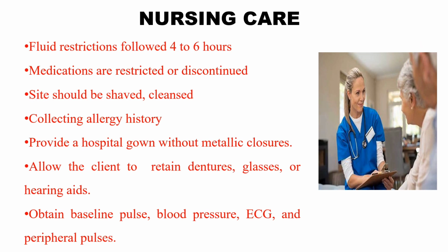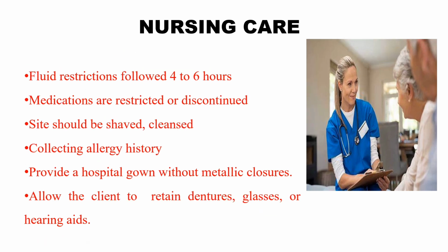Fluid restrictions followed for 4 to 6 hours. Here, ensure that dietary and fluid restrictions have been followed at least 4 to 6 hours before the study. And after that, medications are restricted or discontinued. Ensure that routine medications are restricted or allowed with permission from the physician, and that anticoagulant medicines have been discontinued.